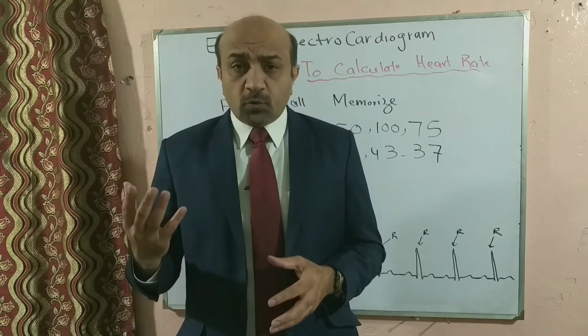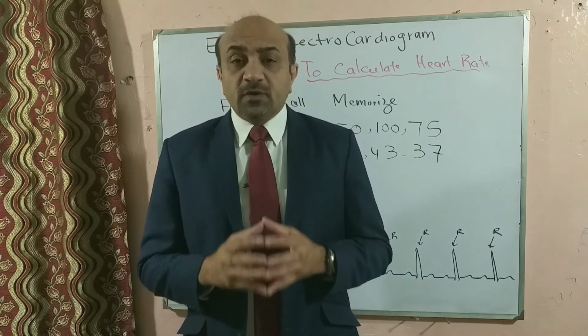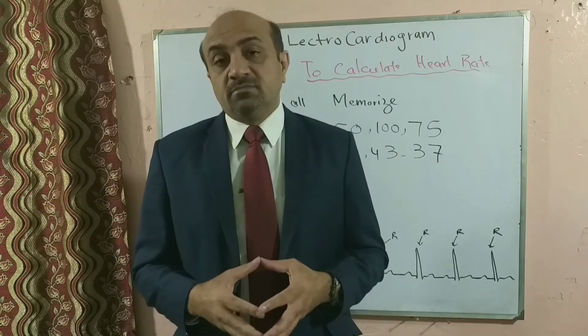So there are four ways, and in this short clip we will talk about the first method, because I want to make short clips so that you guys can understand it properly.